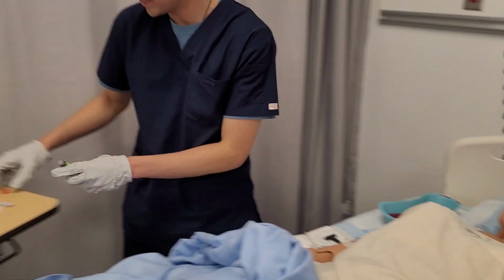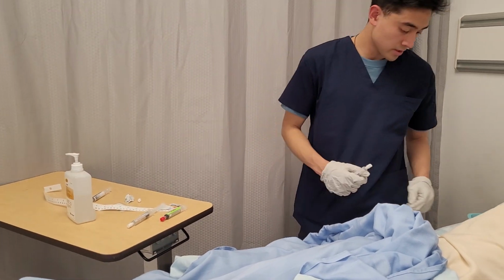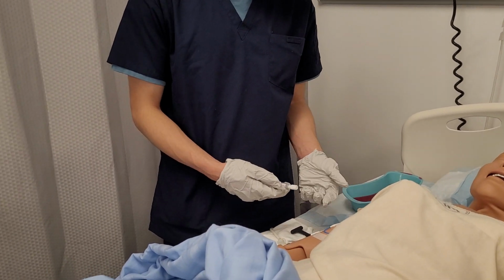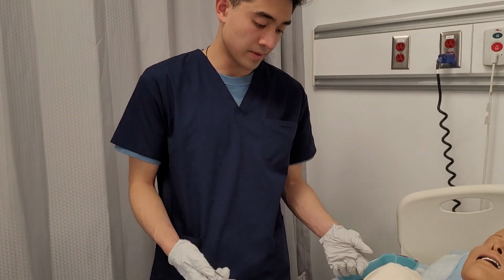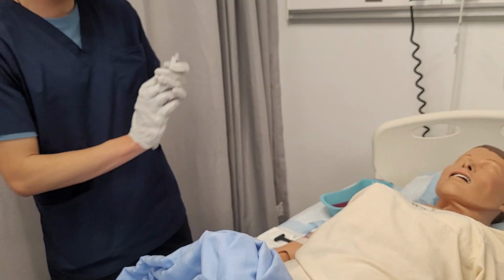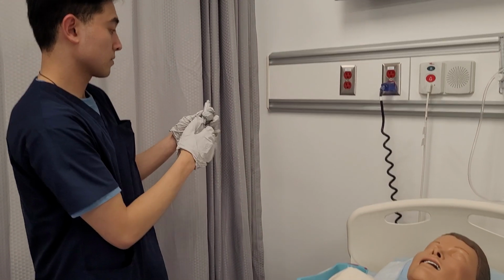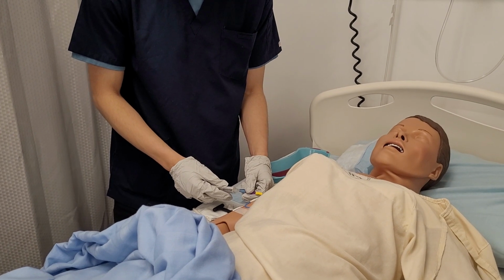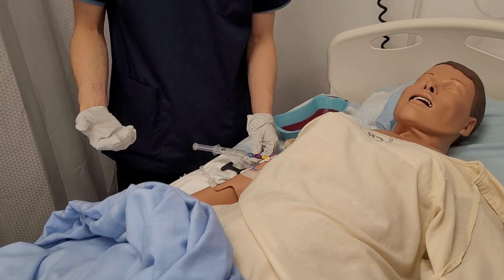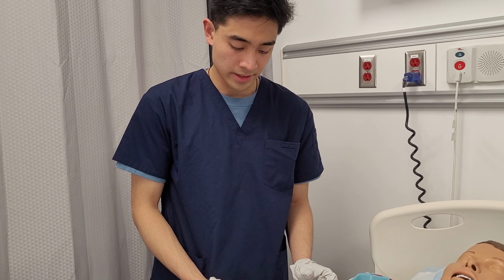All right. So I'm going to give your PICC line another flush, just to make sure there's no medication left in the lumen. And I'll be flushing at the same rate as the medication for the first 3 mils.